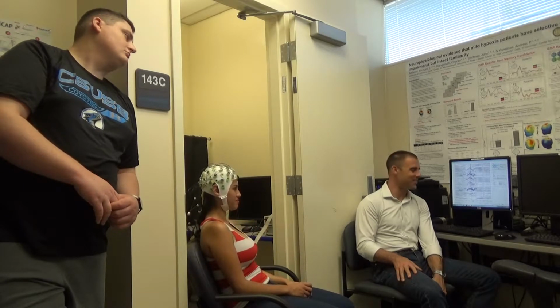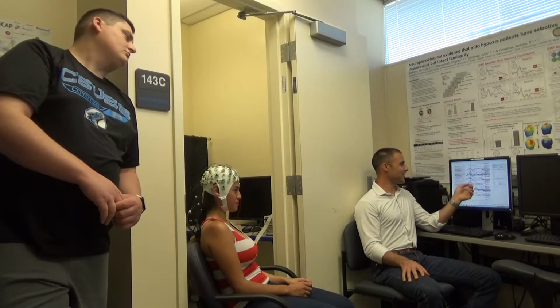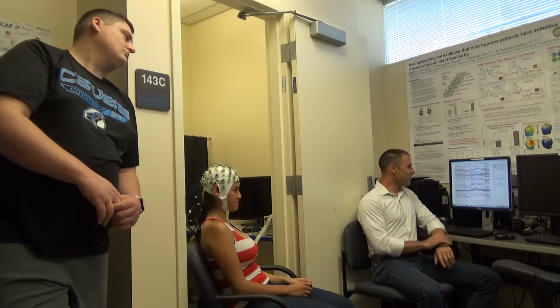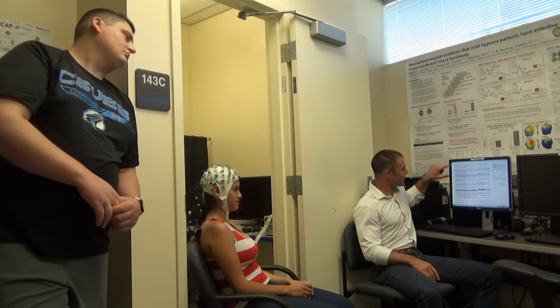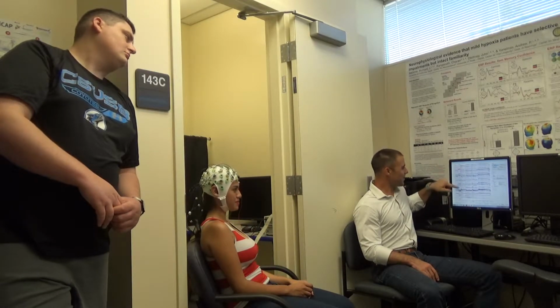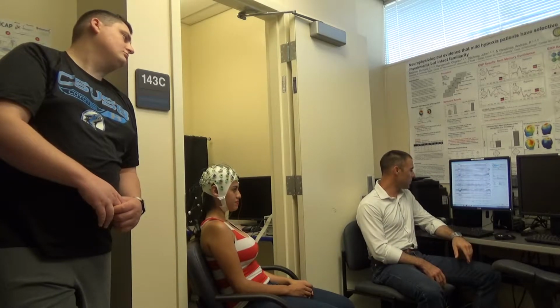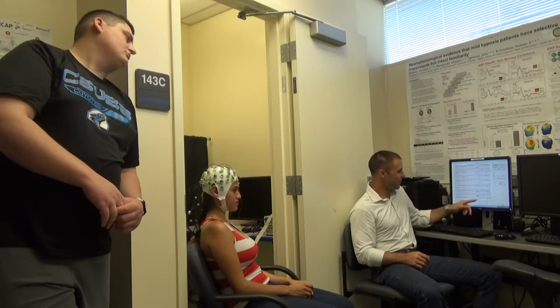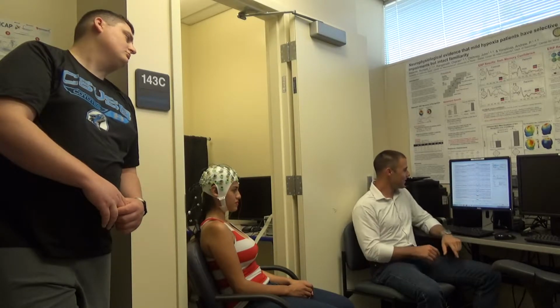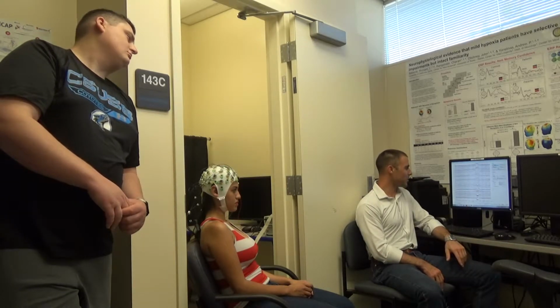Yeah, you have a lot of eyes on you. But you see this here, right? Let's say things are getting more active because now she's laughing, or let's say if you pretend to yawn, you see how that changes all the activity here. You saw that in some of the trials you already worked with. And if you move your eyes to the left, like saccade left, and then saccade right, it goes back down the other way. See the saccades there? Those are a lot of the artifacts you have. Blink, saccade, blink, and we can see that moving along.